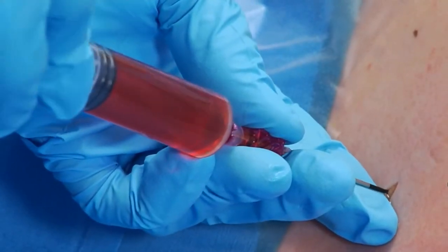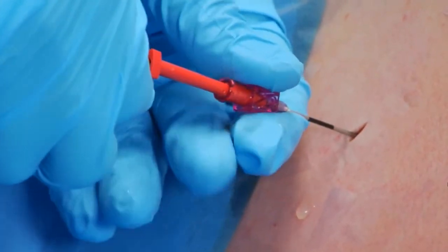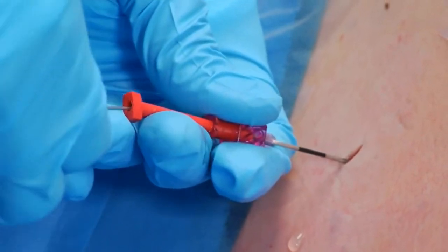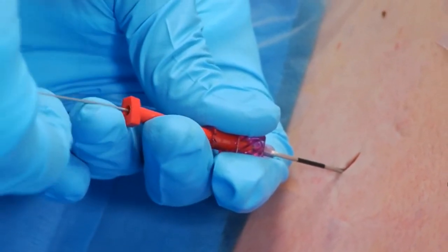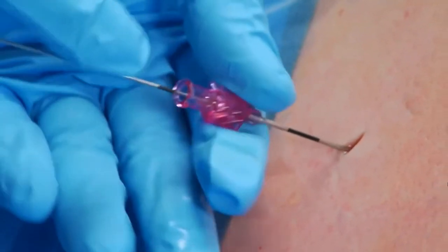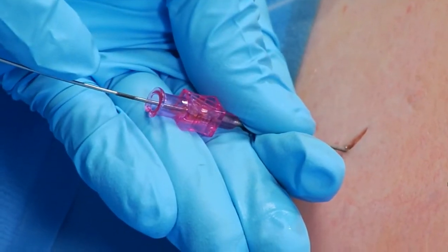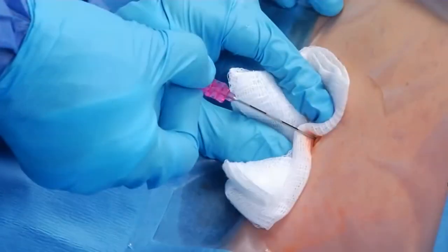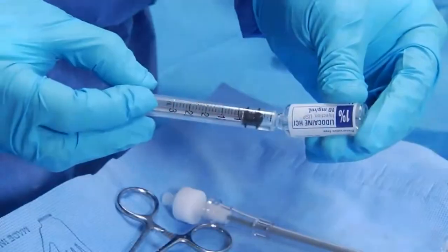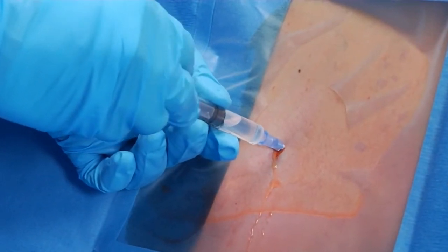When the appropriate drainage site has been identified, advance the soft J end of the wire guide through the needle and into the pleural space. The wire guide should pass through the needle and advance into the pleural space without resistance. The skin level marker on the distal end of the wire guide can be used as an insertion depth marker on patients with normal anatomy. Remove the needle, leaving the wire guide in place. Liberally inject additional local anesthetic into the intercostal muscles surrounding the wire guide.